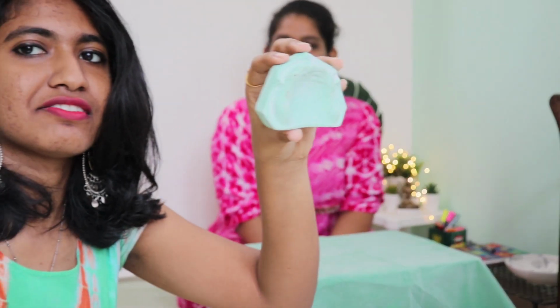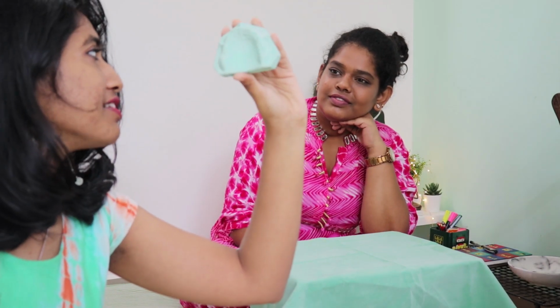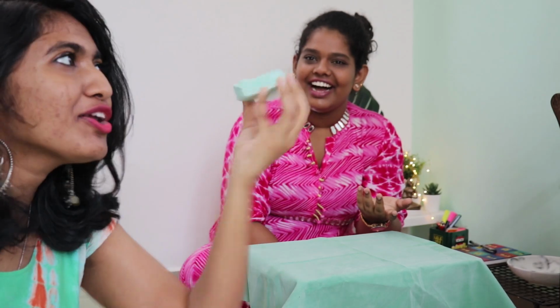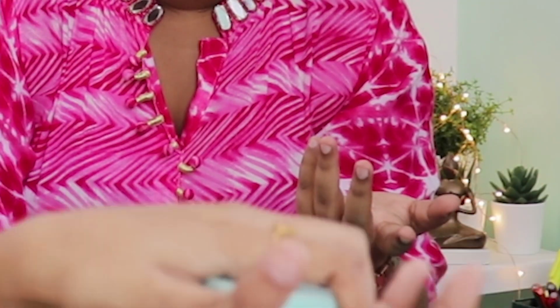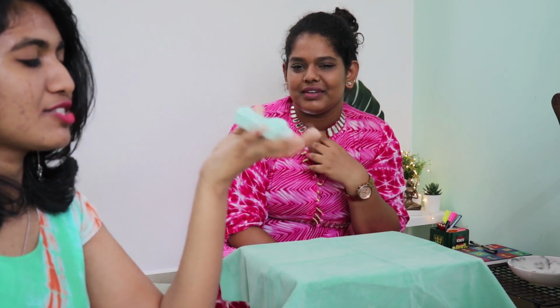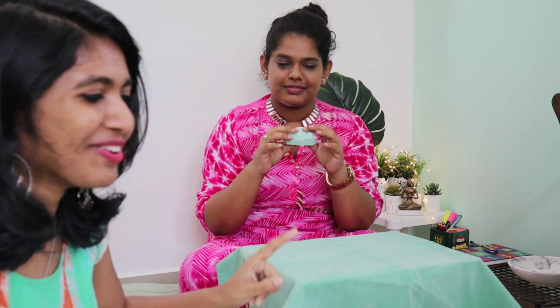Okay, so first, this is the first thing that I'm going to be giving her. What is it called? Guess. What do you think? Mold. No, mold is what you have, this is what you take from it. It's called a cast. It's a basic question, I should know. Yeah, this looks like a shark's mouth. That's your maxilla, by the way. That's the upper jaw.